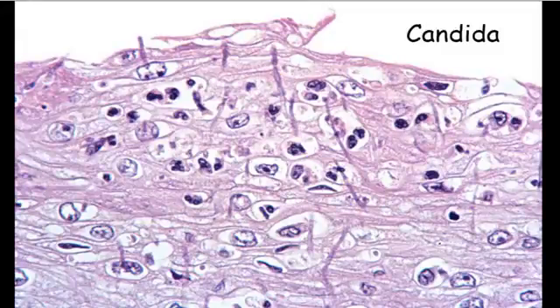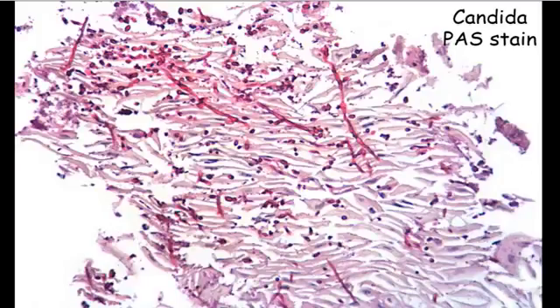But if I have a couple of neutrophils and clinically if there's a suspicion and I don't see them, then I'll order a GMS. And here you can really see how they grow perpendicular to the axis of the superficial squamous epithelium. And oftentimes these clumps fall off and are dead and just sort of off to the side. Here you can see a ton of both yeast and pseudohyphal organisms.